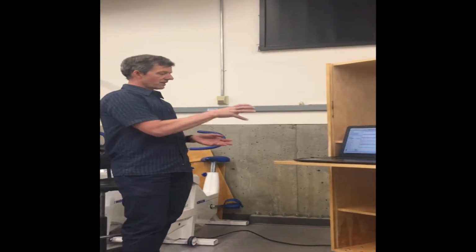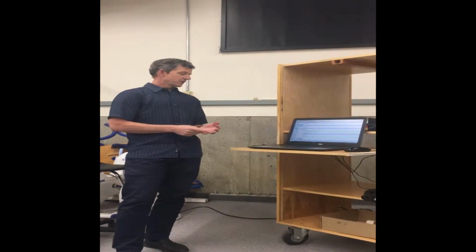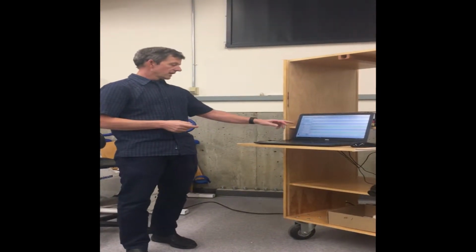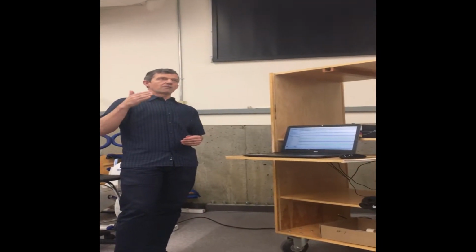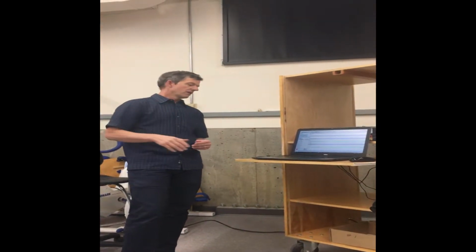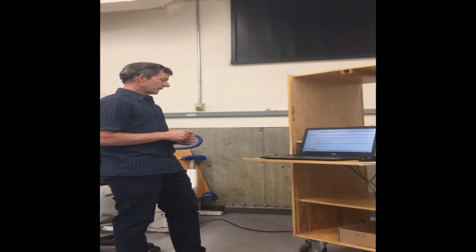This is the screen that we're going to be looking at. It can monitor 6 channels at one time. So in real time, it's going to tell us what the CO2 concentration is, what the O2 concentration is. It's going to give us the expired airflow rate. It's also going to give us the airflow cumulatively. So it's not going to give it by minute, but it's going to say at the 3-minute mark, the subject has breathed 70 liters. So it's going to be cumulative until the end. But when we do the calculations, it'll tell us what ventilation is in liters.